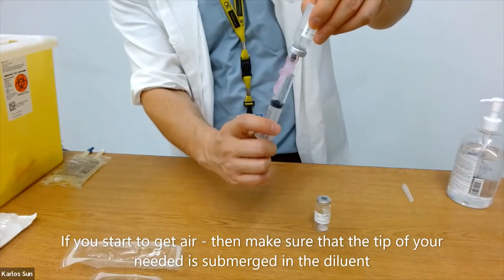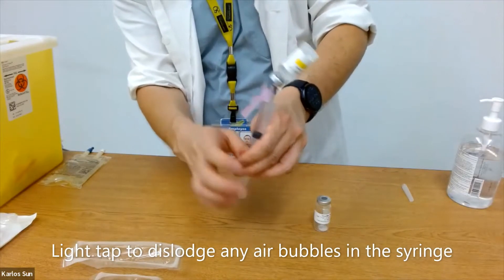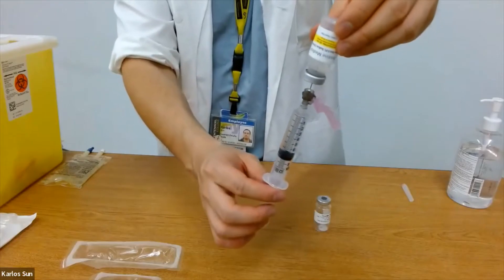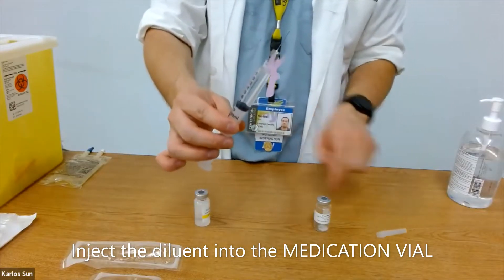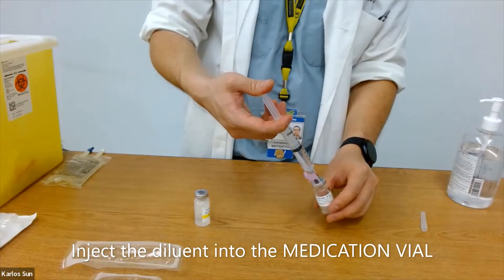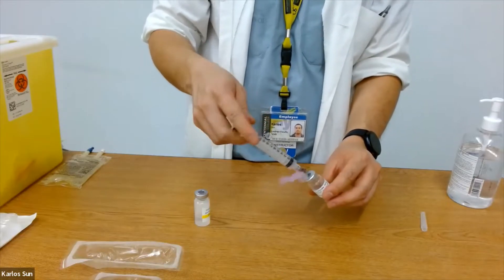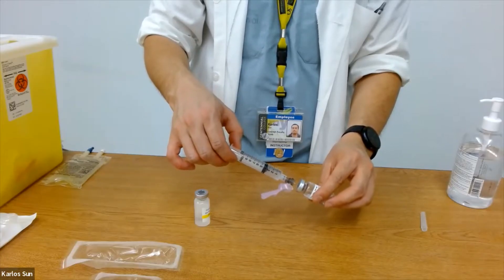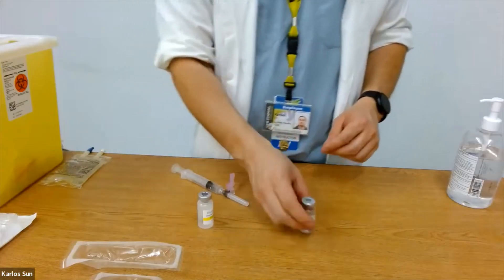If you start to get air, make sure that the tip of your needle is submerged in the diluent. Lightly tap the syringe to dislodge any air bubbles. Inject the diluent into the medication vial. Recap your needle for re-use. Shake the vial to mix the medication thoroughly.